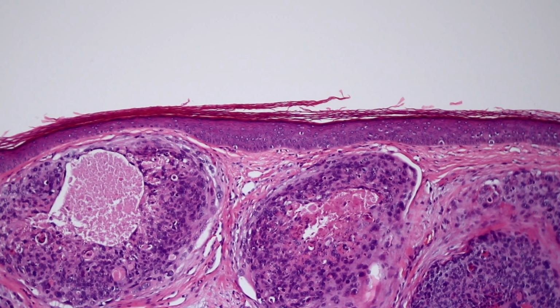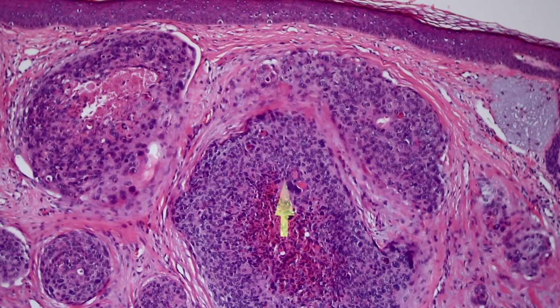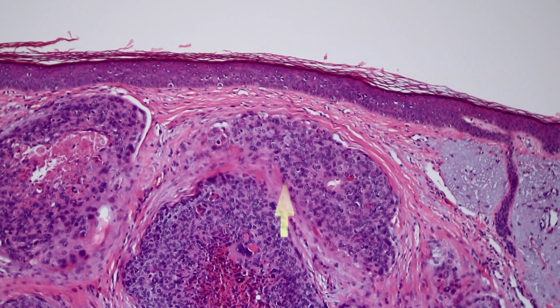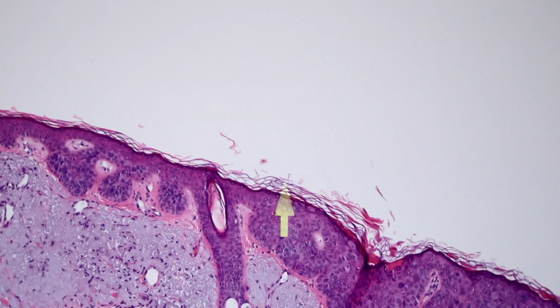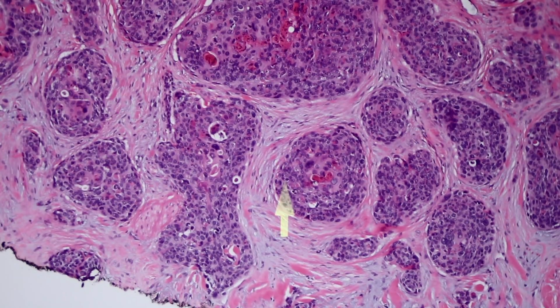Notice something here. There is no atypia in the epidermis over top of the squame. There is no actinic keratosis or squamous cell carcinoma in situ. This is just normal looking epidermis, maybe a touch atrophic, but the point I'm trying to make here is that you would think that it would be this stepwise progression from actinic keratosis to squam in situ to invasive squame, but in real life that is not always the case. In fact, it's often not the case. Sometimes you have invasion with only a little connection to the epidermis. Sometimes you have actinic keratosis that jumps straight to invasion without ever becoming squam in situ. Sometimes you have squam in situ off to the side, but you don't really see it right over top of the invasive carcinoma components.